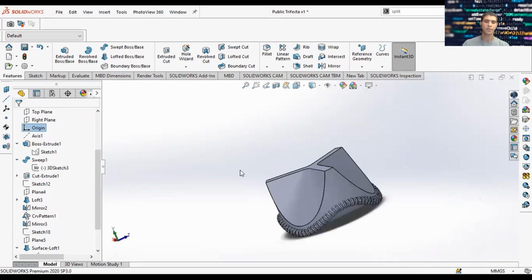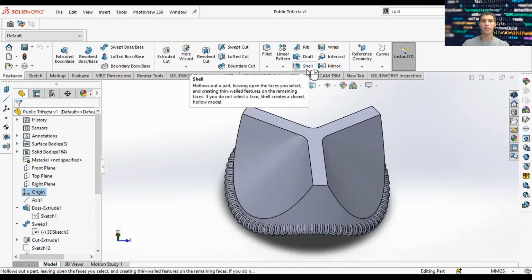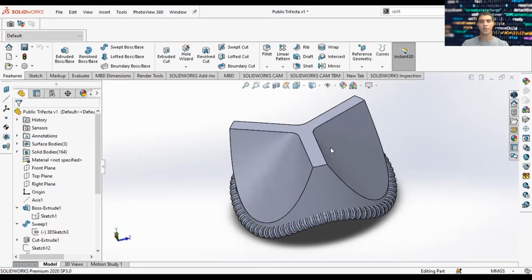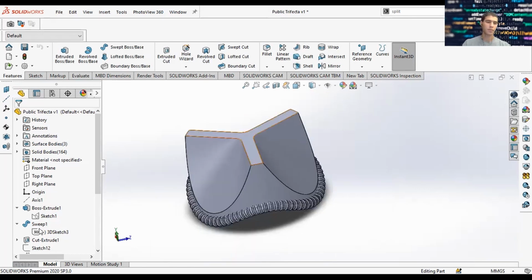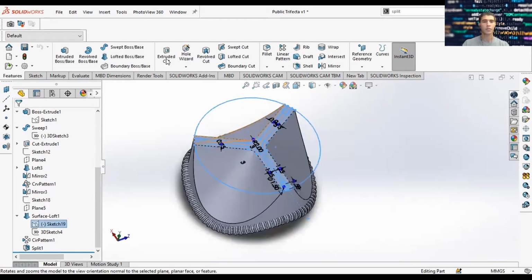Cool. So what's left? What's left is, let's do something called shell. Let's give shell a try. So shell is going to make a hole, or create a shell out of this contour between this face and this face. Let's see if this works. All right, so shell does not work. One reason why shell might not work is because of the split bodies tool. But there's a way around this. Let's go back to our sketch. Sketch 19. Let's create an extrude cut from it.